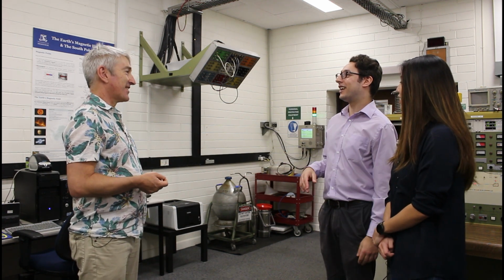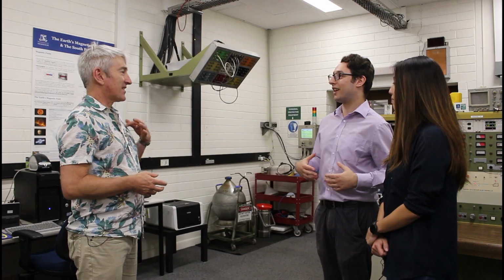Yeah, so a good example there actually is if someone eats and their stomach distends, or if they are bigger, or even if they're breathing. If their lungs, which are full of air, have more or less space in them, the stopping range of those protons will change, and that's one of the main limiting factors of proton therapy.